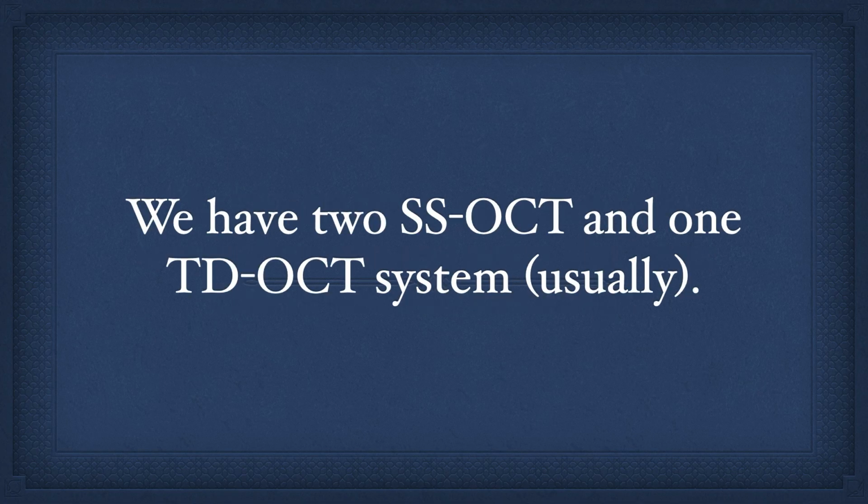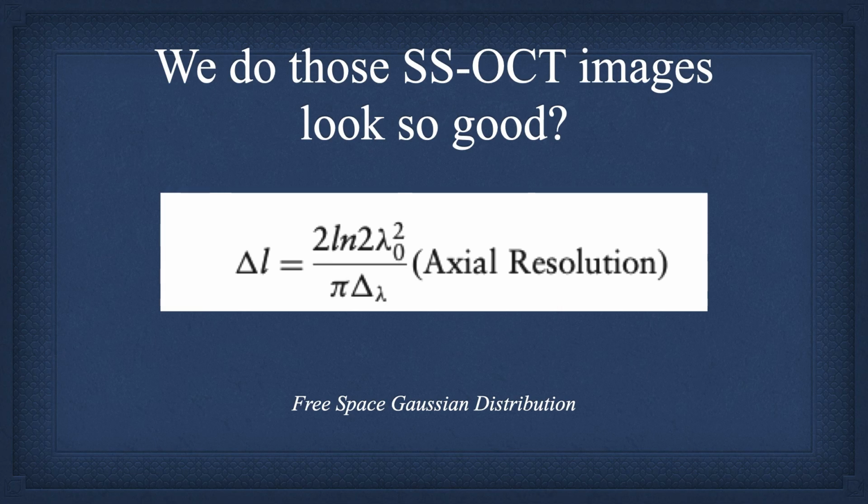And I don't want you to think that I'm biased toward one versus the other. We have two SS-OCT systems, and they're commercial, Thorlabs and Lightlabs, and they're great for applications. But we have a breadboard system that's predominantly a time domain OCT system, but we do switch it over to a swept source OCT system at times, and we will in the experiment shown toward the end of the talk.